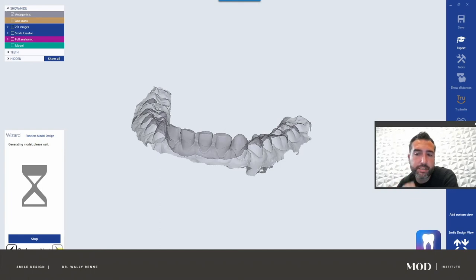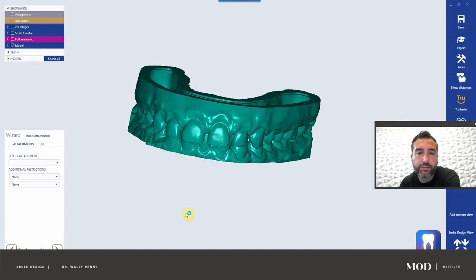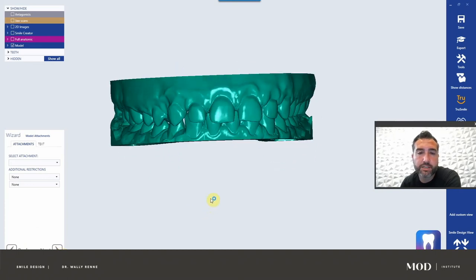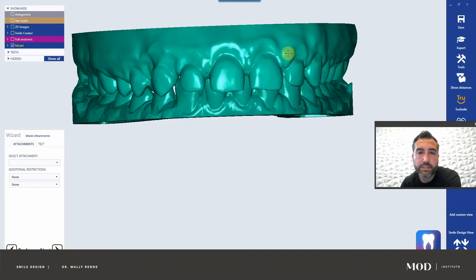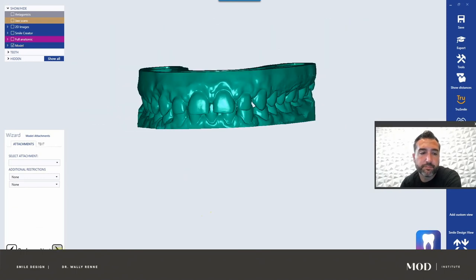I'll show you two ways to print the upper with the wax up. You can print both — kind of like a 'this is where you are and this is where you're going' thing — but know that you edited the gingiva and that's going to transfer over to the before. So you'd want to load a generic visualization mesh and print that, because this model has the gingivectomy already. Now we have our models ready for 3D printing.